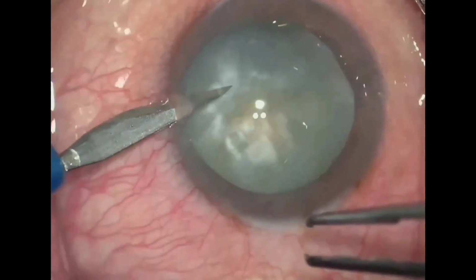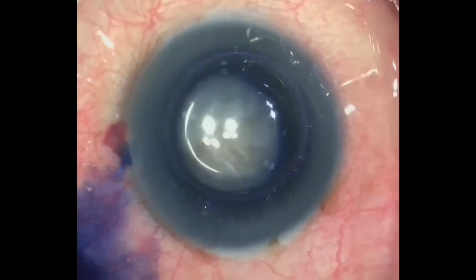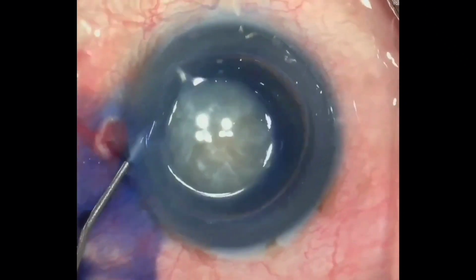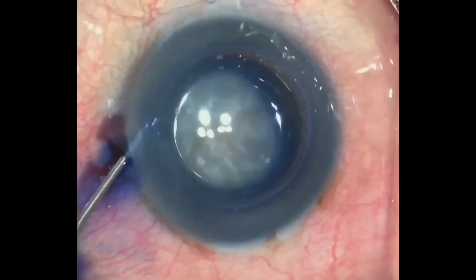First, a sideport incision was made and air was injected into the anterior chamber. This was followed by injection of trypan blue to stain the anterior capsule. We can see that the incision was small and it did not allow free outward flow of the fluid.